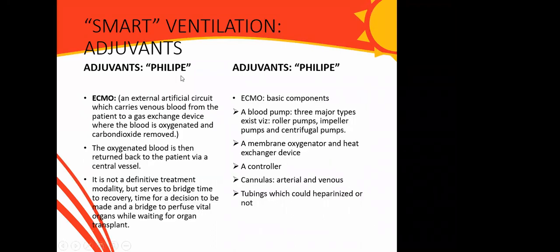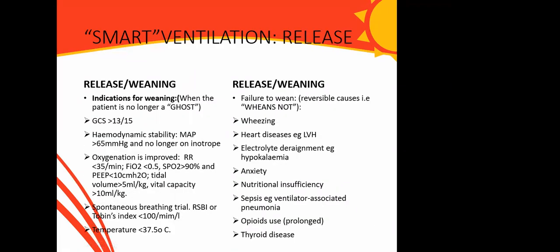Okay, ECMO, all right, we'll talk about that as we go on. So weaning, the R stands for release or weaning. When do you wean the patient off the ventilator? And I coined the phrase: when the patient is no longer a ghost.